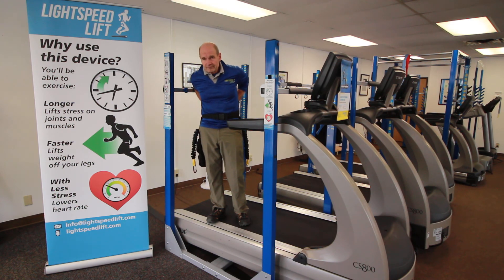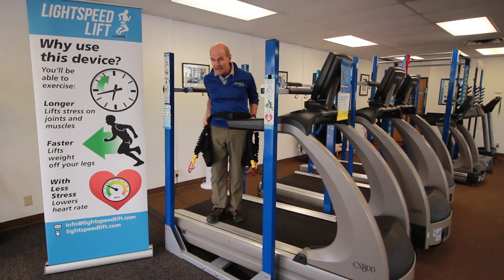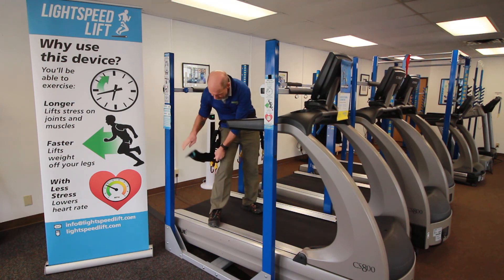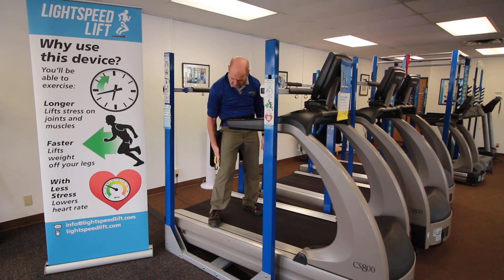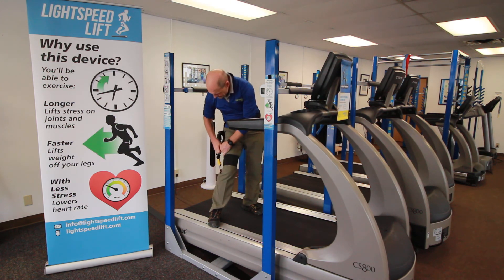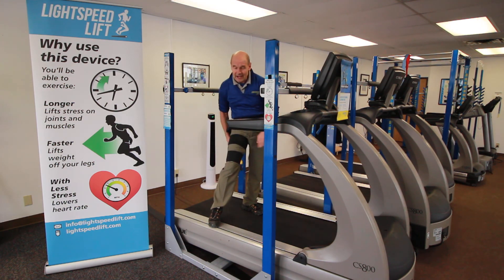Buckle on the belt. Tuck the tail if there is any. Slide the straps so that they're straight down the leg, straight down the side. Bottom one on first, just above the knee. Second one toward the top of the thigh.